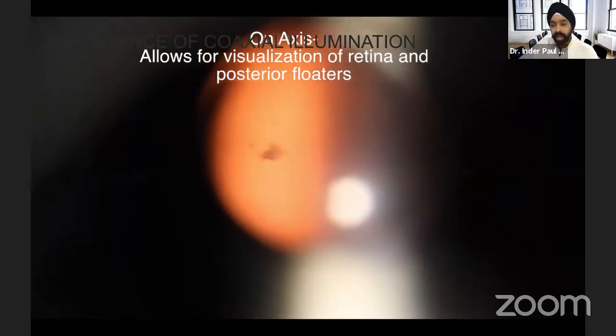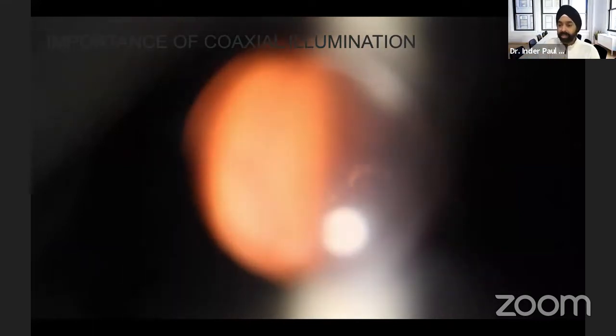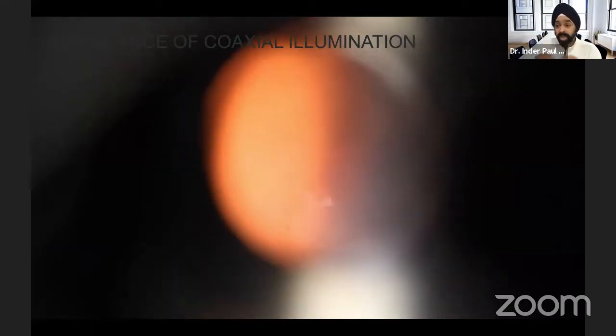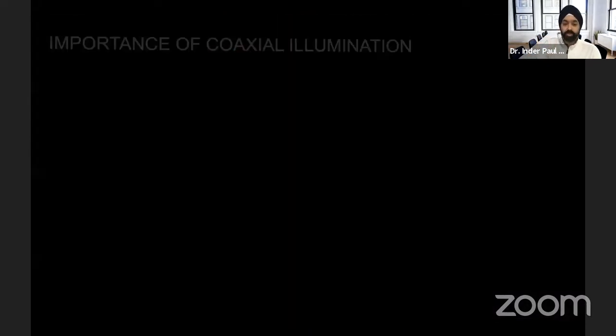So what I have just done in the last 10 seconds here is given myself spatial awareness, spatial context. Now I know as a surgeon where I am at all times. Now I can feel comfortable. The retina is out of focus. I'm in the middle of the vitreous and I can fire the laser. As we'll get to, even at 10 millijoules, the shock wave is only about 300 microns. So we're not going to cause a large disruption of vitreous. This is why the illumination is so important.